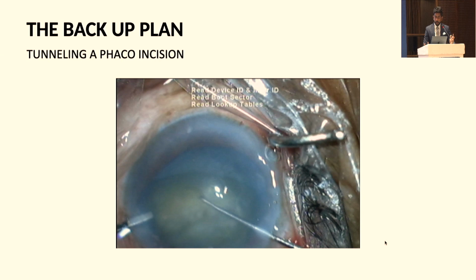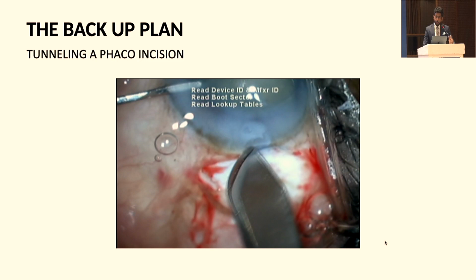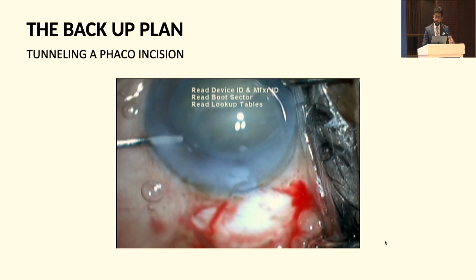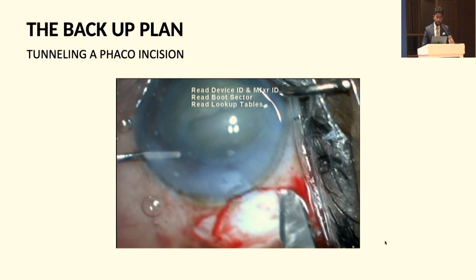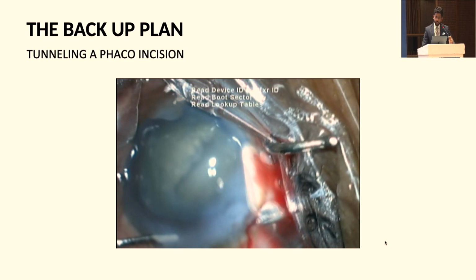When a postgraduate starts off training for phaco, he might go through complications such as a runaway rhexis or any form where you might have to convert to an SICS or an ECCE. So this is a simple innovative way where you just continue the phaco wound, make radial cuts, backend cuts, and include the phaco wound into your tunnel. This way you avoid any new incisions, have a good anterior chamber, there is no iris prolapse, and postoperatively you tend to have a smaller astigmatism. You can see that we are proceeding with a regular scleral groove here and including the original phaco incision tunnel.